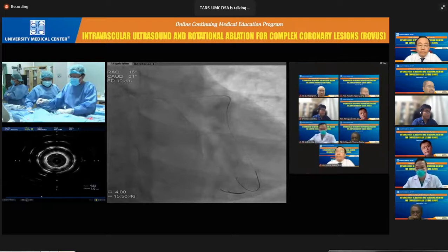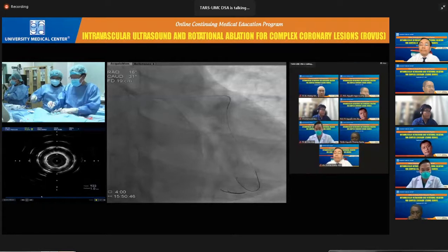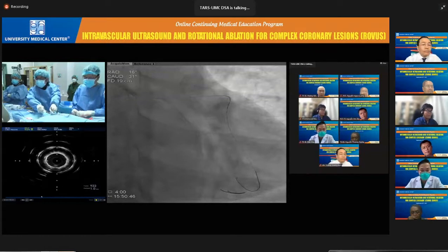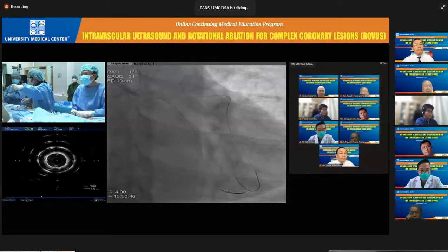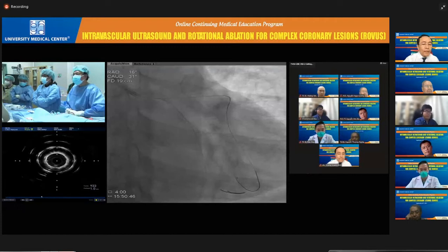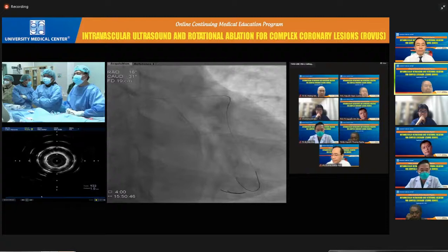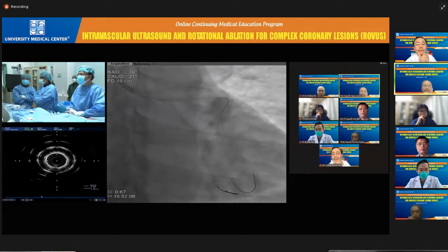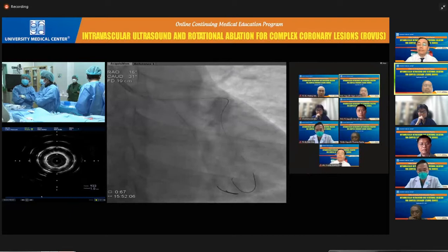So Dr. Quang talks about the left main stent deformation in left main PCI. Yeah, I think that's an important point when we do the left main bifurcation, when we put a stent from the ostium of the left main. In this case we're discussing the kissing balloons, and for the long-term result, everything depends on the restenosis of the side branch.